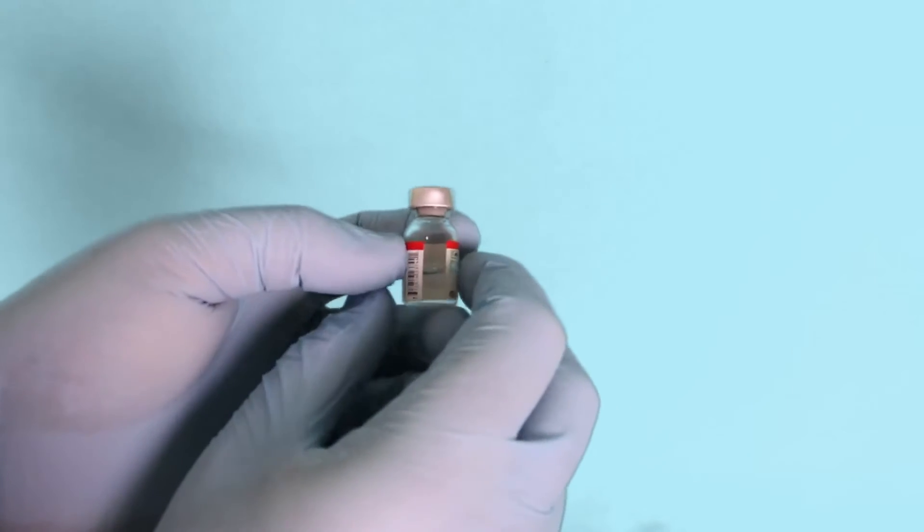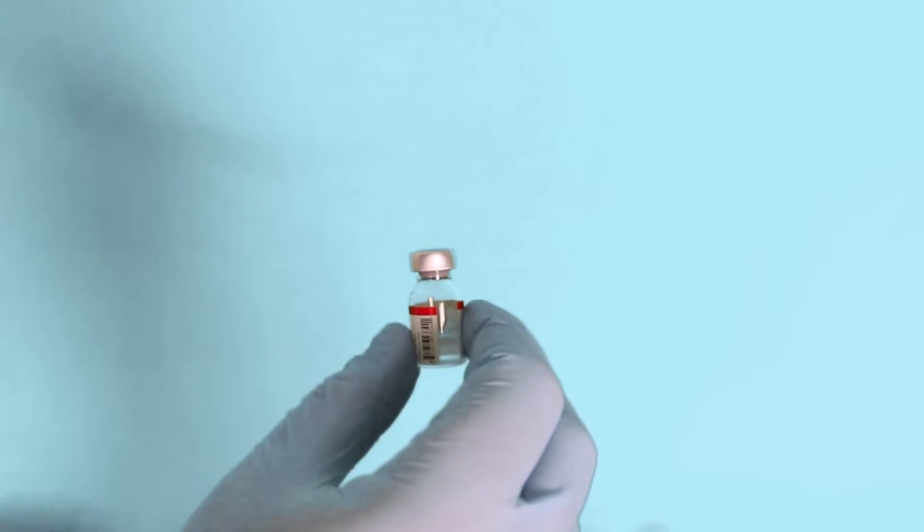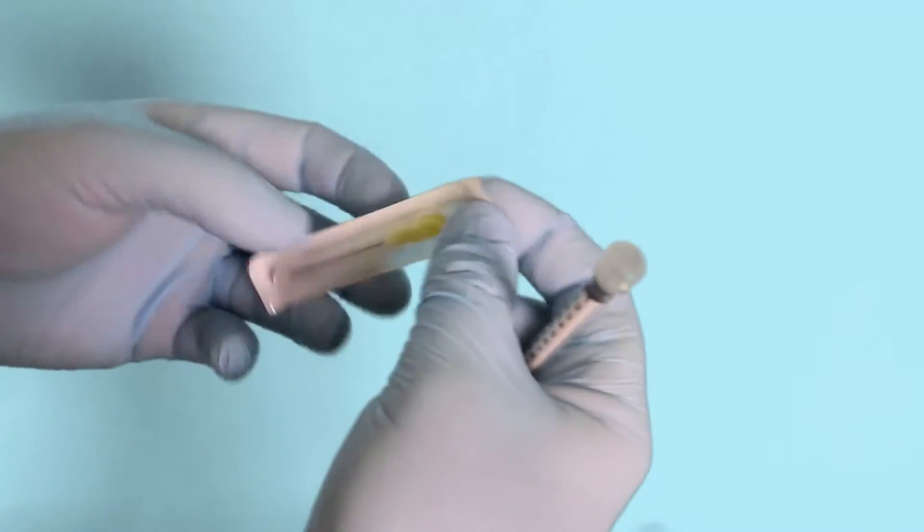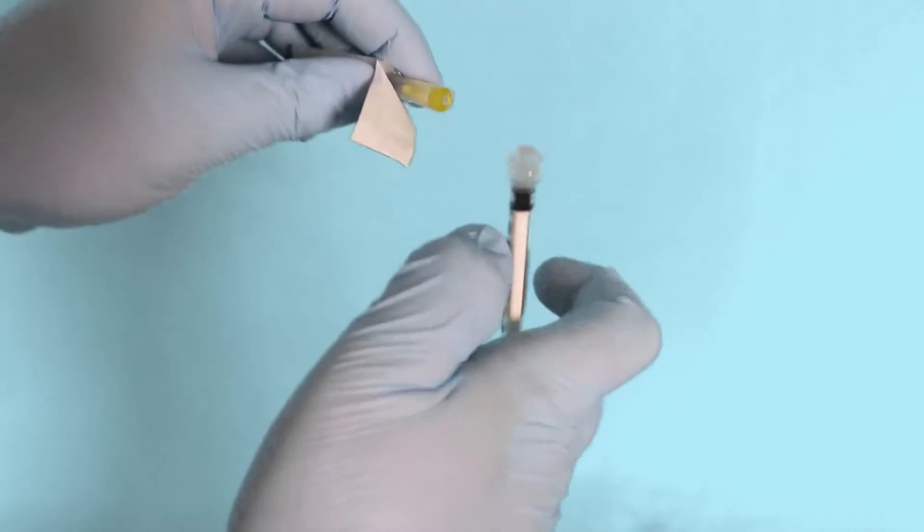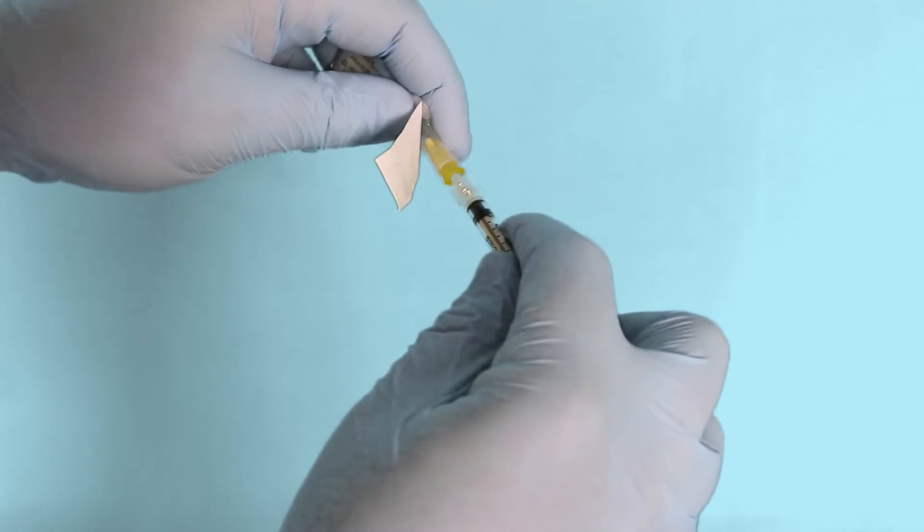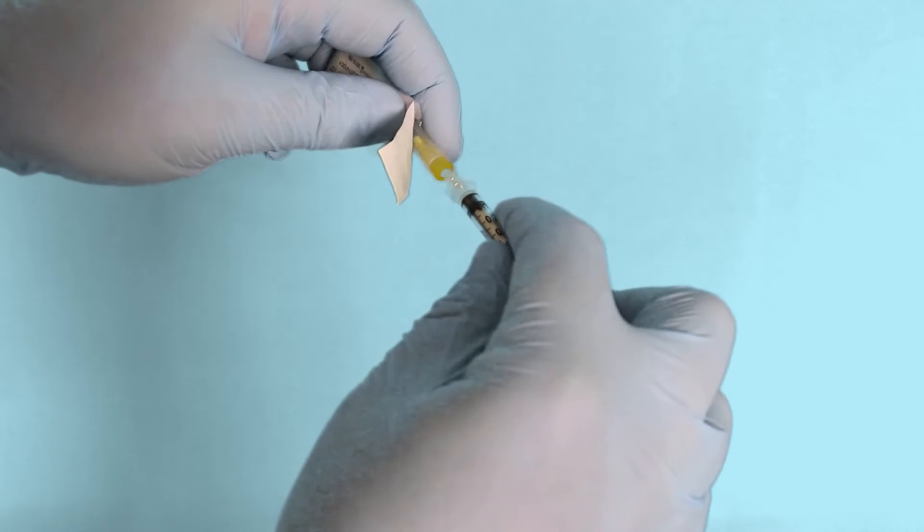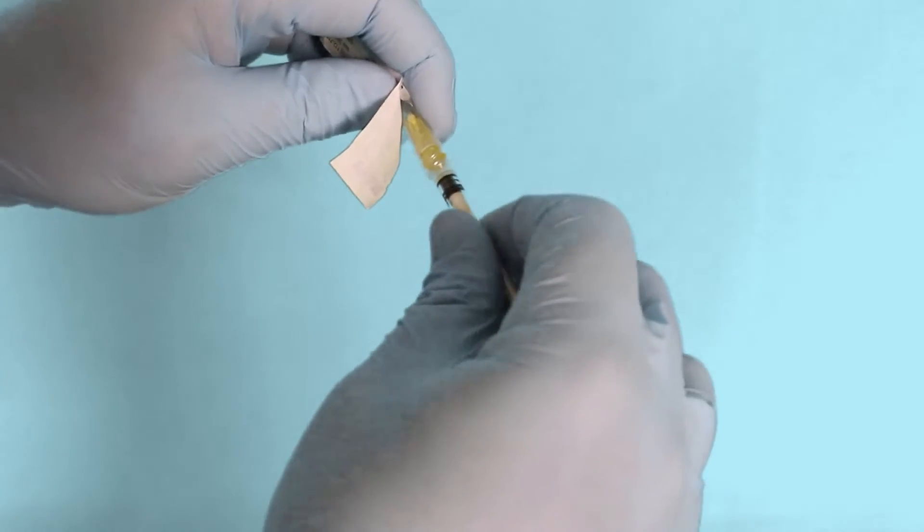Secondly, in order to remove fluid from a vial, we first need to inject an equal volume of air into that vial as the amount of fluid we wish to withdraw. This compensates for negative air pressure that would be created by attempting to remove fluid. The exact amount will depend on the size of dose you intend to inject.